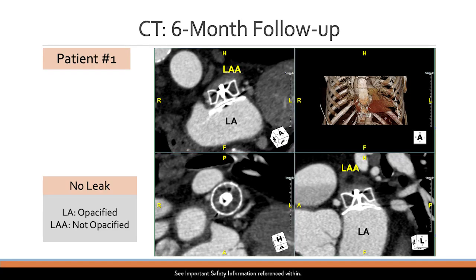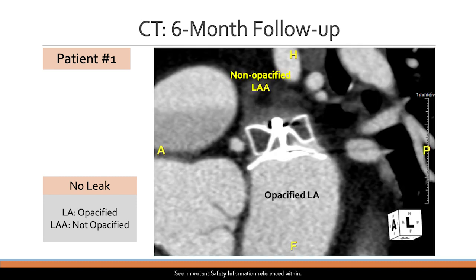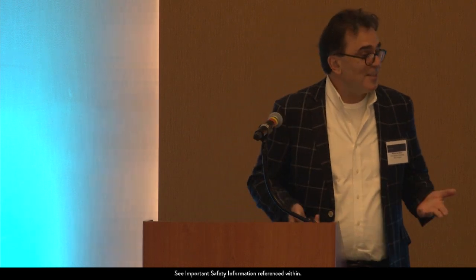Okay, so this is a few more images from CT, and this is a CT image of a patient. So what do you think? Is it good occlusion or not? There's thrombus in the appendage. Of course, that's expected. That's what I said, that's a tissue.